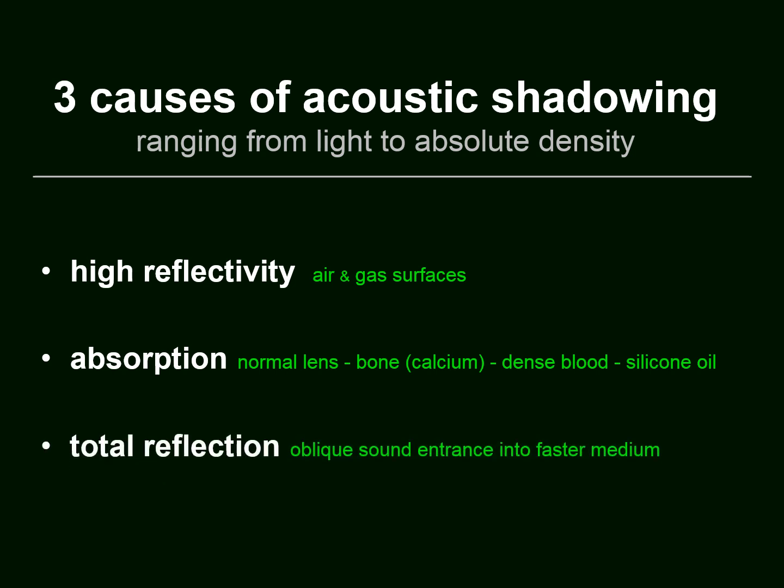And then total reflection that we have just mentioned, with the refraction angle getting 90 degrees or larger, so at oblique sound entrance into a faster medium. These are the three causes of acoustic shadowing that we're dealing with in echography.